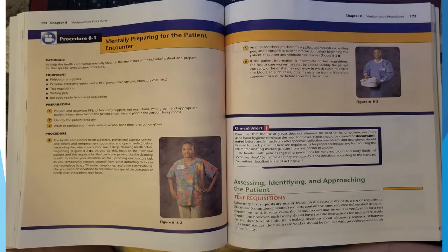Preparation. Step 1, prepare and assemble your PPE, your phlebotomy supplies, test requisitions, writing pen, and appropriate patient information before the patient encounter and prior to the venipuncture process. Step 2, identify the patient properly. Step 3, wash or sanitize your hands with an alcohol hand rinse, then put on gloves.